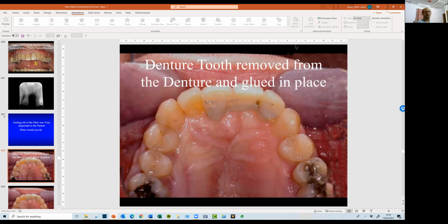Have you ever done that with your orthodontic patients? Oh yeah, you mean to prevent space opening, right? Yes. We don't use the twisted one. We have another wire. I'll show you the picture. It's a more refined one, a very thin wire, but the cross section is a little bit different. It's a U-shaped cross section, and it's pretty expensive. I'll show you the picture so you get the idea. But it's not a twisted one. Yeah, send it to me.